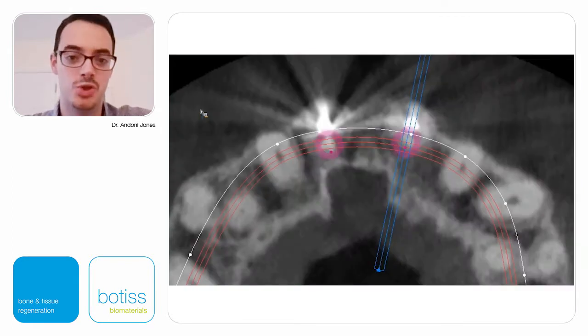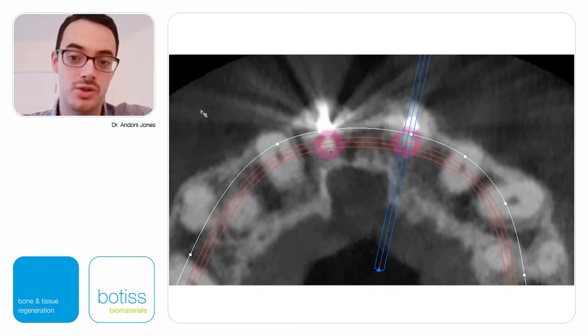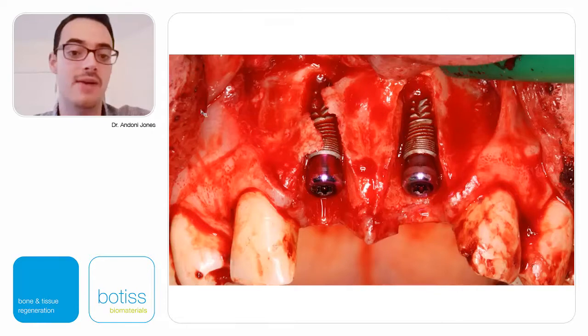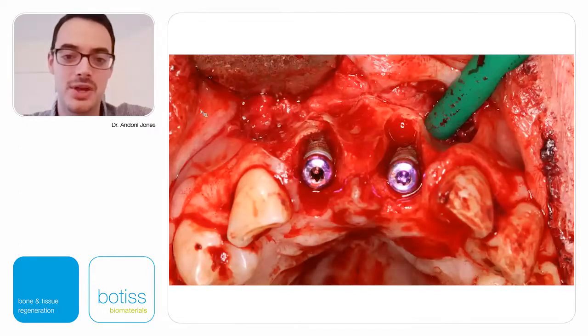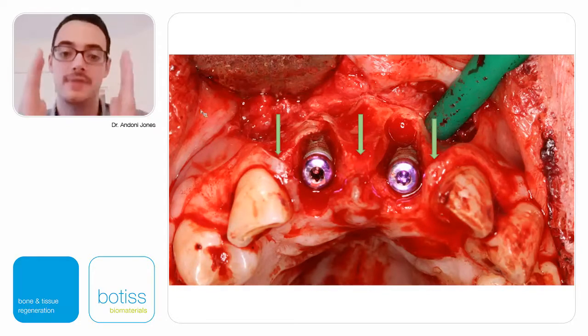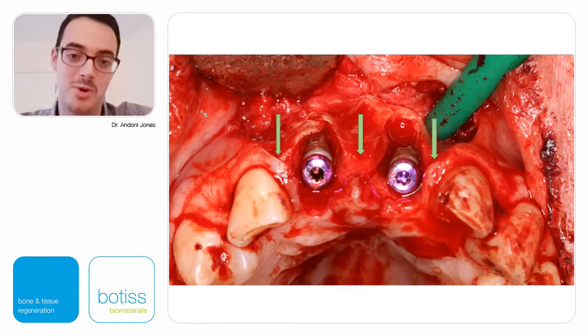From an occlusal view, the roots are very prominent on the buccal surface — even if some buccal plate remains, once the teeth come out it will be completely dependent on the root and will dissolve very quickly. The implants need to be placed in the correct 3D position. Despite very gentle extractions, the buccal plates were gone. The inter-implant bony peaks are slightly more palatal than ideal because the roots are so prominent, and if we only graft the thin slot of missing buccal plate without addressing that concavity, we won't achieve two millimeters of bone facial to the implants.